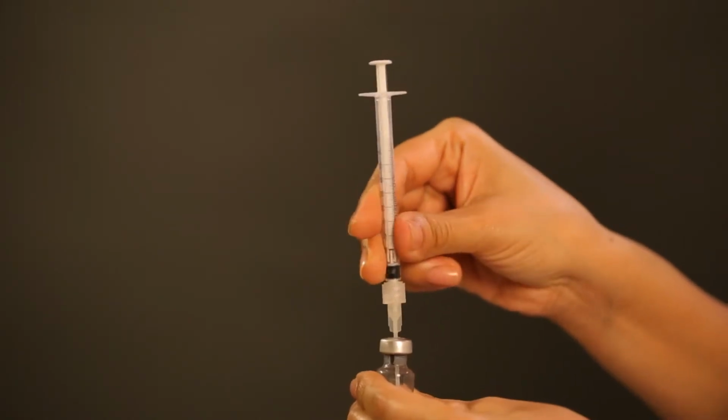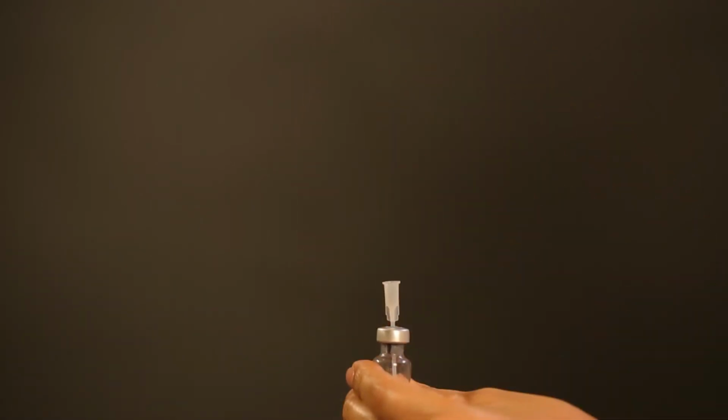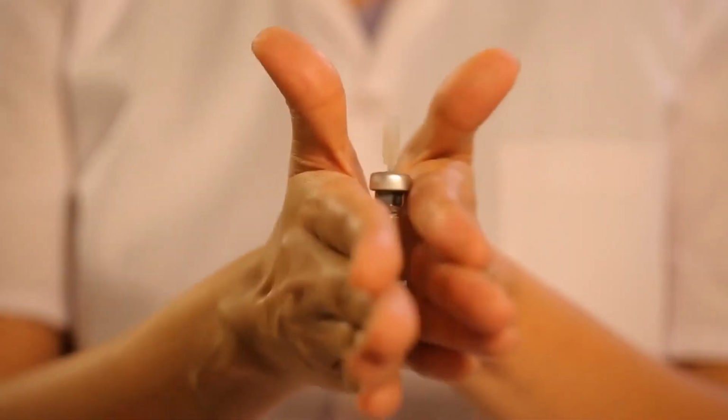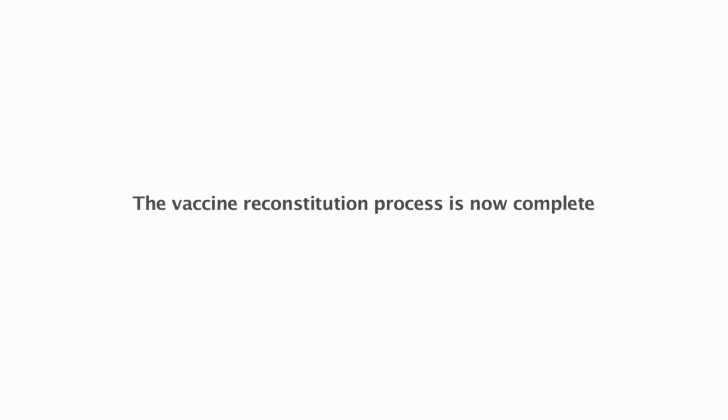Disconnect the syringe from the needle to break any residual vacuum and to avoid impairment of the vaccine dissolution process. Rotate the vial gently between the palms till the cake is fully dissolved, in case of any delay in dissolution of the cake. The vaccine reconstitution process is now complete.